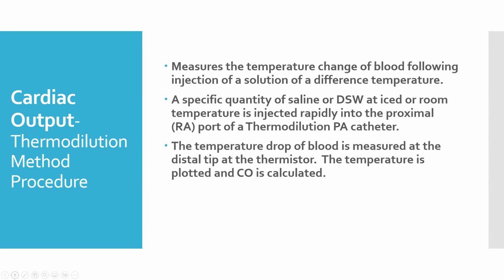So if you need to, pull out your old edition. By the way, this stuff is still applied from 5 editions ago with Egan's. The 12th edition is out now, and we're working on the 13th edition as we speak. But some chapters change a lot. This chapter on hemodynamics changed because it recognizes the addition of some of the new methodology. So it has changed, but they still talk extensively about Swan-Ganz catheters.